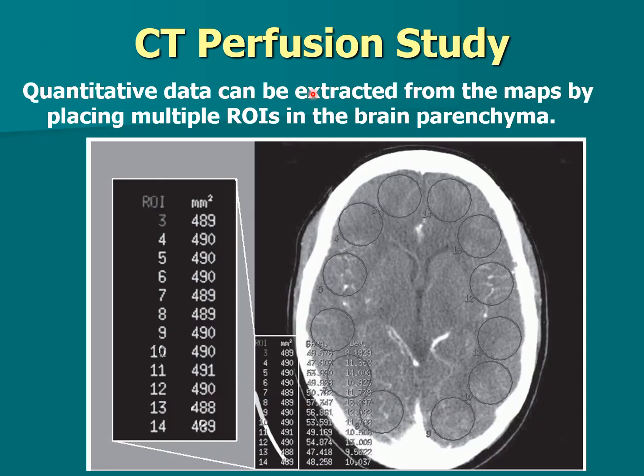We might do something called a perfusion study. There are different places that do these. These are usually to try to demonstrate if there has been a lack of blood flow to an area. So it is a quantitative study.